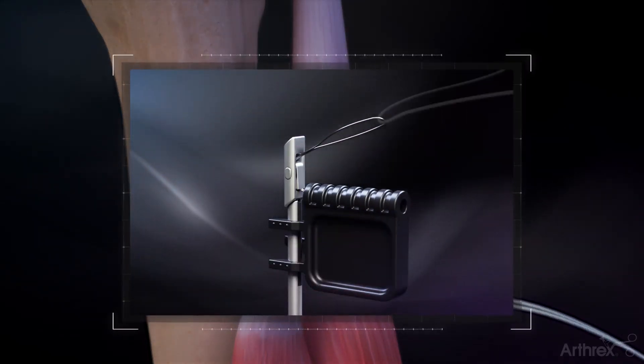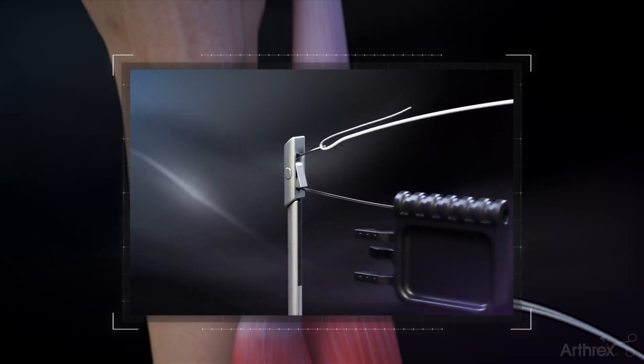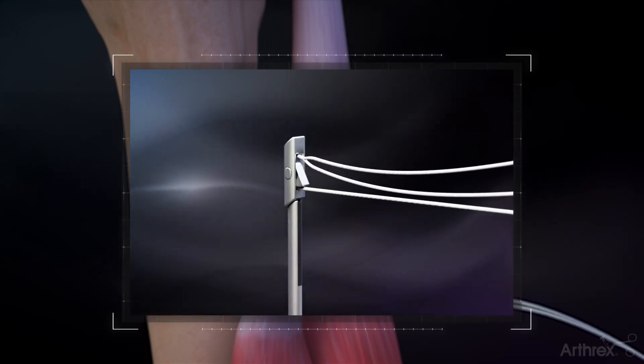Load the tail of the fiber link into the button loader, pull the tab to shuttle the suture through the button, stopping just before the loop enters the locking jaw.